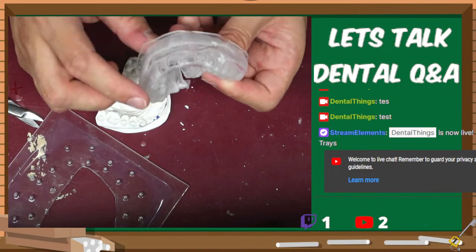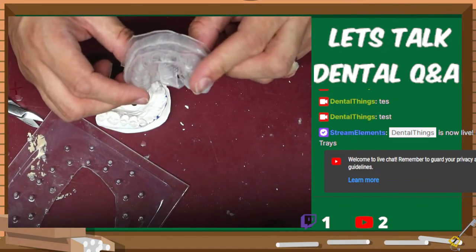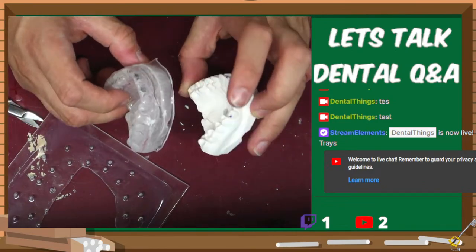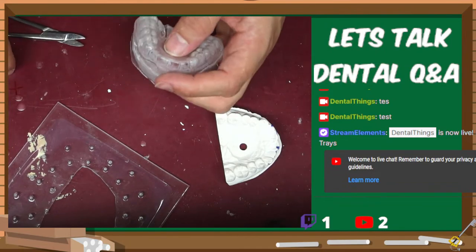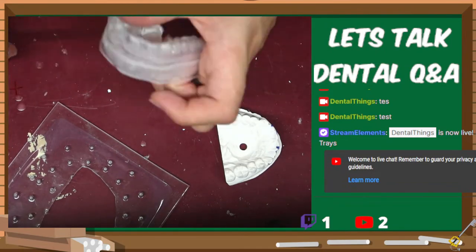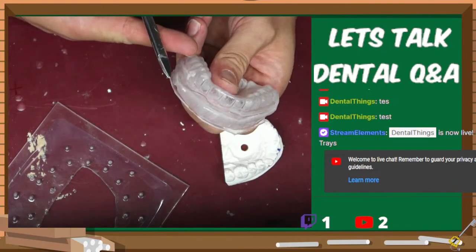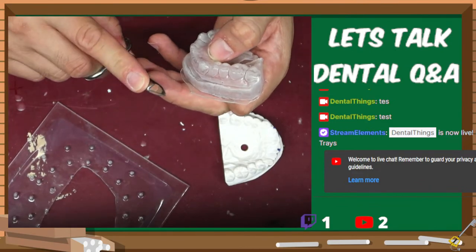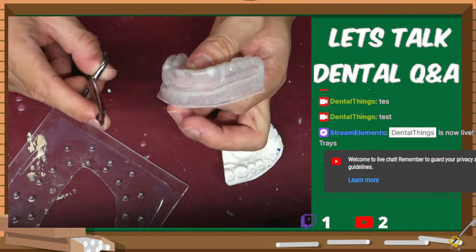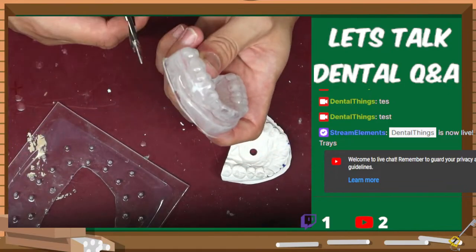But I have my markings on this. It resembles my plaster model that I have here. So now I can start making cuts across and doing those fun things. And some people will use a hot knife to just clean, just burn across. But you can also use different types of scissors to be able to do the same thing. Even regular house scissors will do for this action.